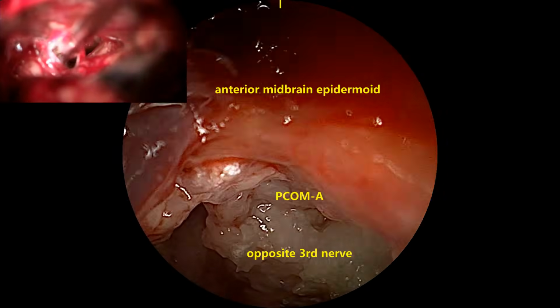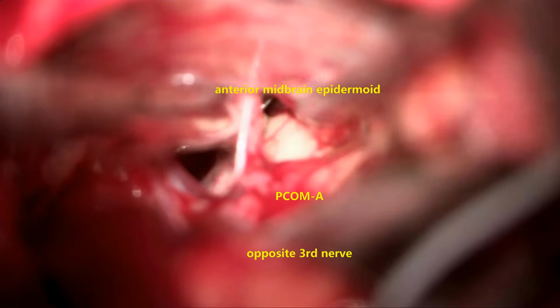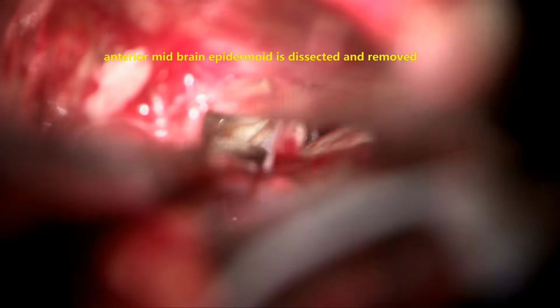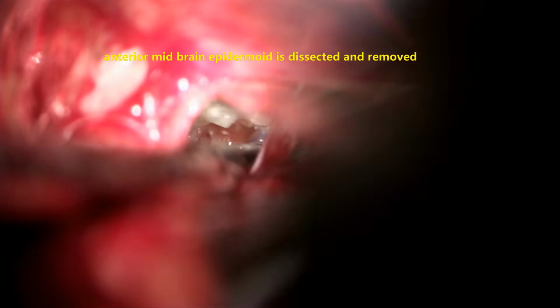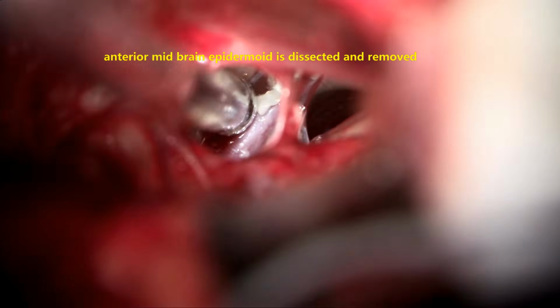We bring in the endoscope and see the remnant epidermoid and its location in relation to the surgical site, and locate that. Again, either we can take it out microsurgically or we can use the endoscope and take it out along with the endoscope help. If it is coming out easily and comfortably with the microscope help, we can take it out.